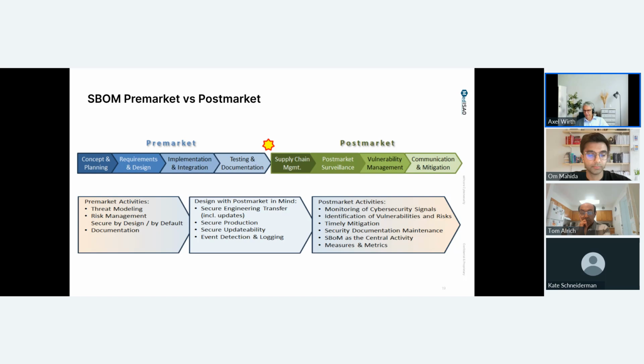And then, of course, you want to have and establish measures and metrics that allow you to justify your processes, but also to analyze and learn from things that need to be improved, and also important that you can communicate then up the chain in your company so that your executive management and your boards are aware of the quality of your post-market processes and potential gaps that need to be addressed either through investment in tools and technologies or through improvements of processes and other examples.